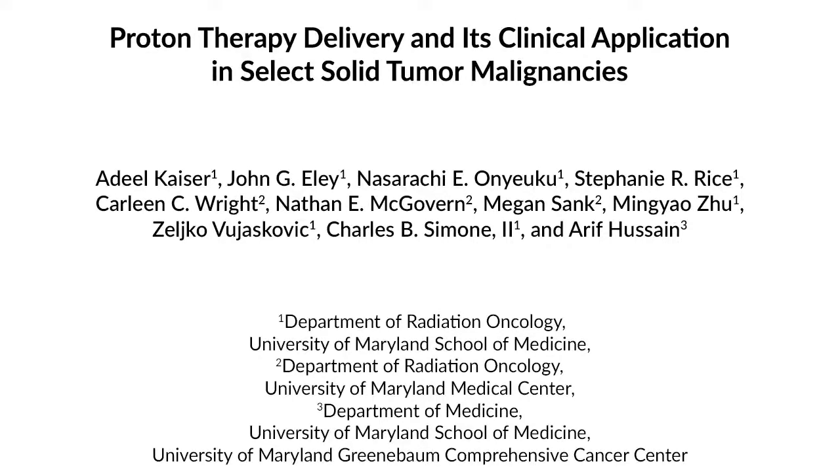It is important to understand the potential and evolving role of proton radiation therapy for treating certain cancers over the more traditional photon radiation therapy. An important challenge is to identify and understand the cancer disease states that may be particularly suitable for and benefit from proton radiation therapy.